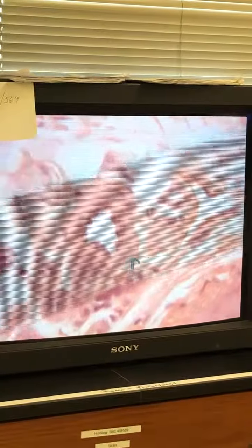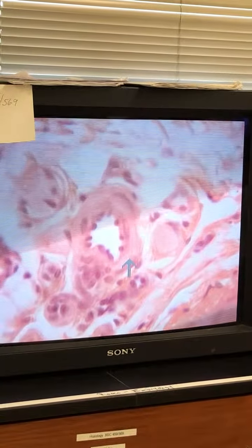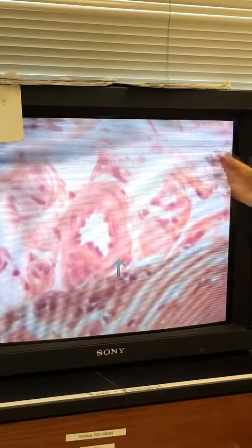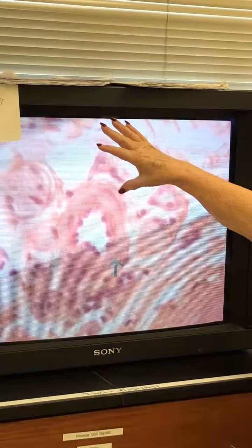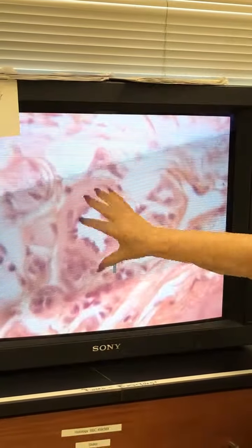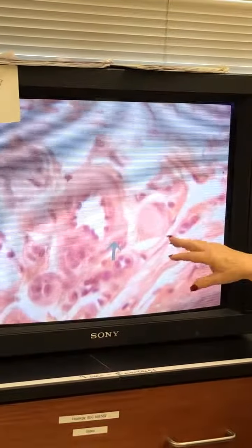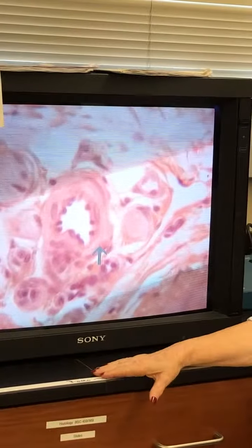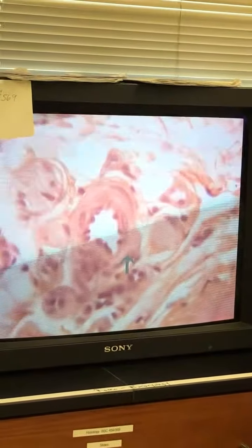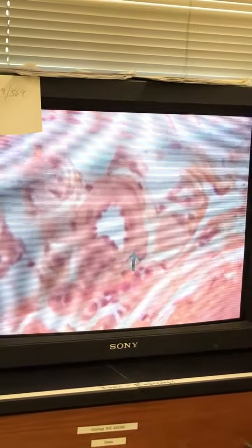This one right here would probably be an artery because it's pretty thick. If we could focus in and out, it's got at least one, if you go around 2, 3, 4, it's probably got about 5 or 6 layers. I wouldn't ask whether it's a specific artery or an arteriole unless it had like 10 or so.